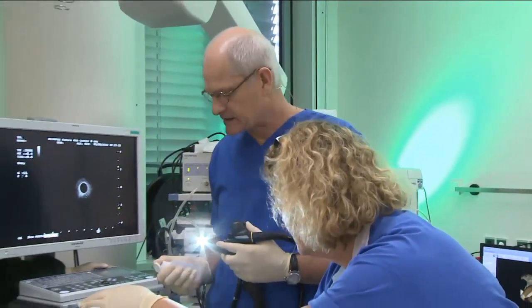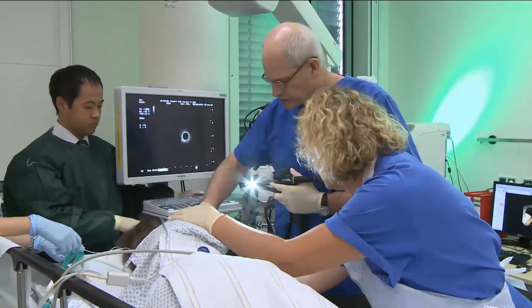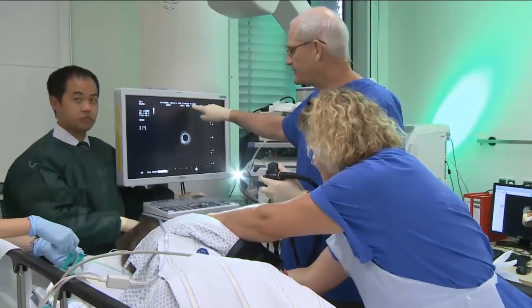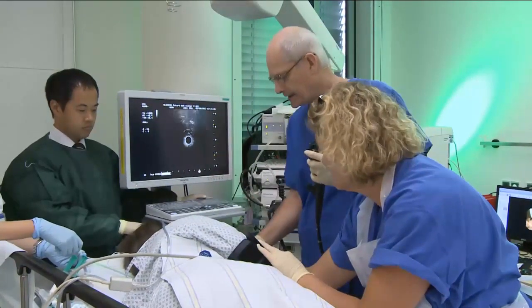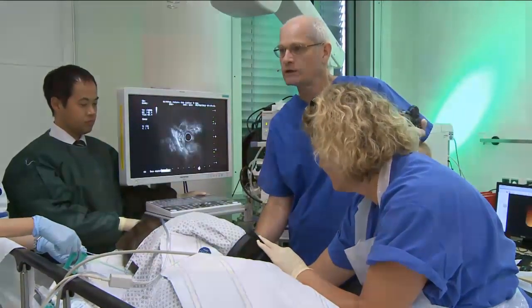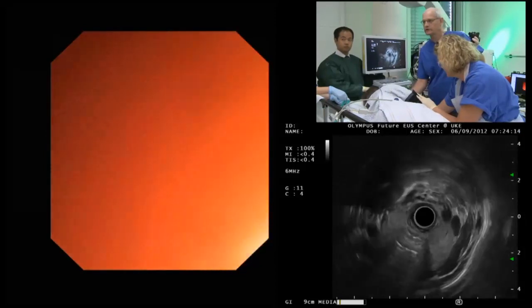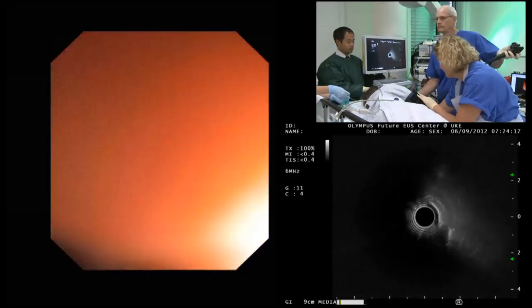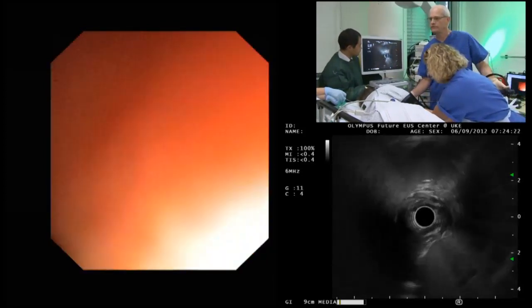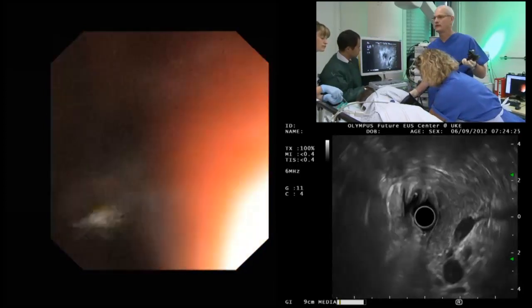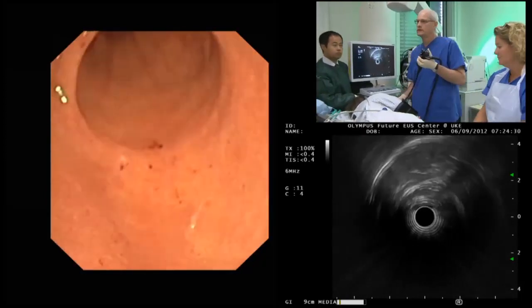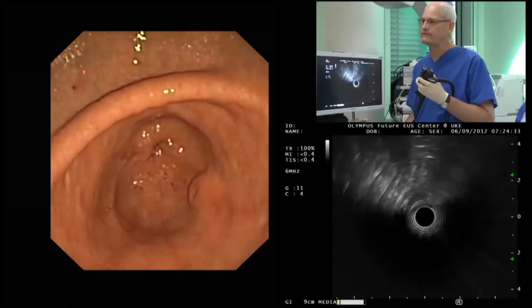I'm using the new Olympus Future EUS Center — that's the equipment I'm using. You'll have a chance to see it in the exhibition area. It drives both a linear as well as a radial echo endoscope. We've intubated the patient and are moving down into the stomach. There's a little bit of water, and there is the lesion in the foreground.